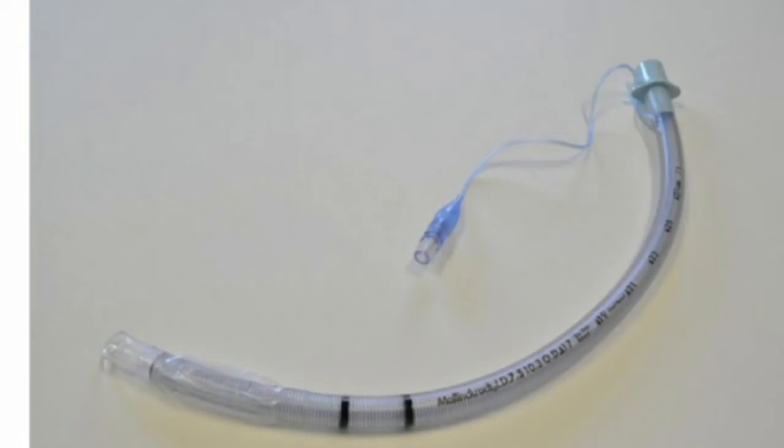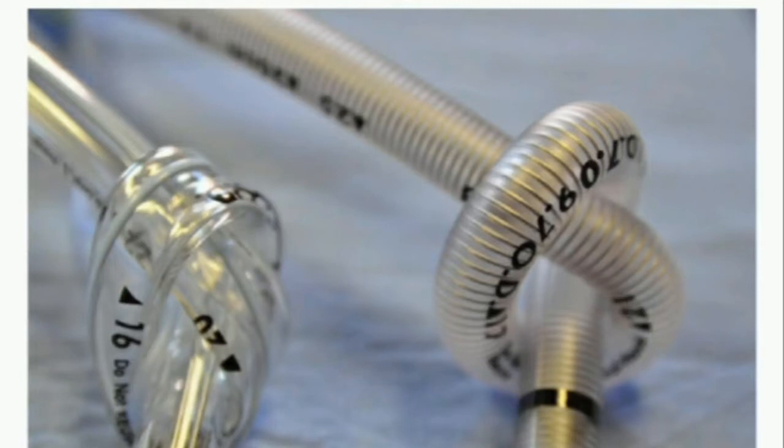By being more flexible than standard ET tubes, armored tubes are less likely to kink and occlude when bent to an angle, which is their biggest single advantage over standard ET tubes.